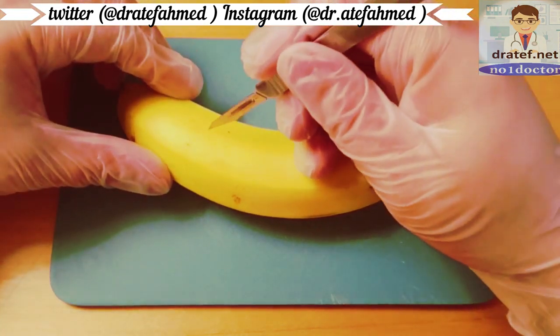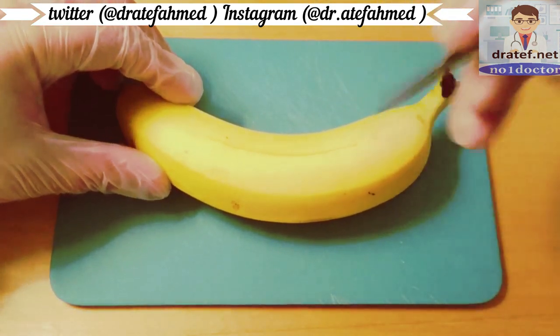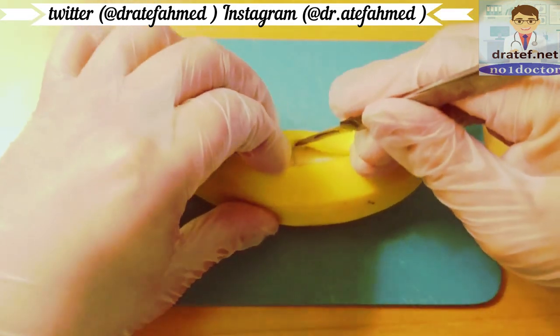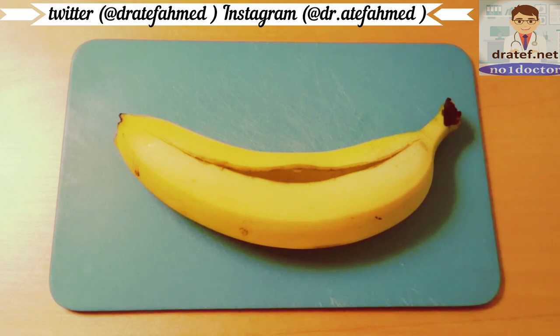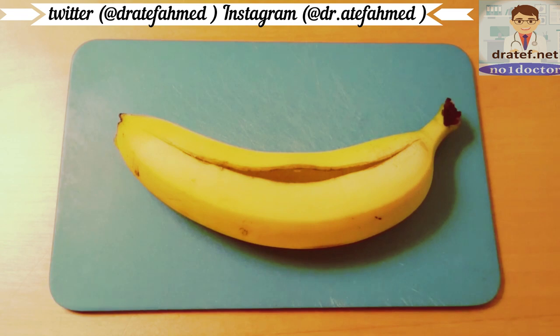Start with preparing the banana. This is making an incision and picking out the pulp. This is a little bit tedious so I will make a jump cut. Now the pulp is extracted. It cracked a little bit during the process, so it will be a little bit more challenging to suture.